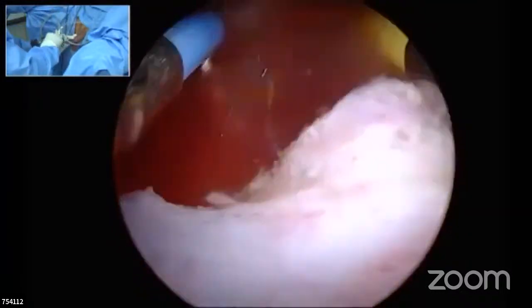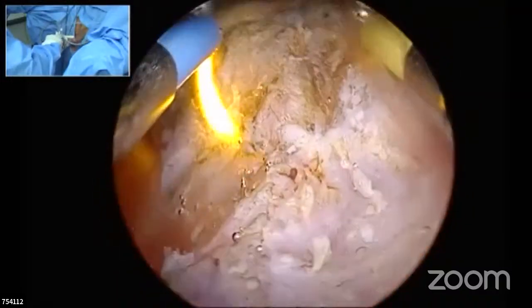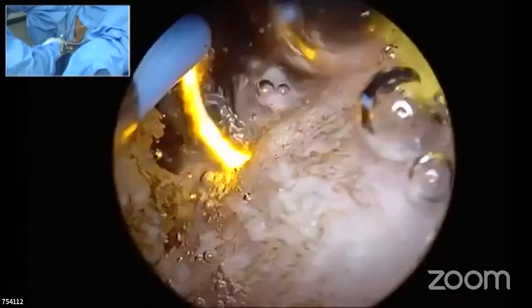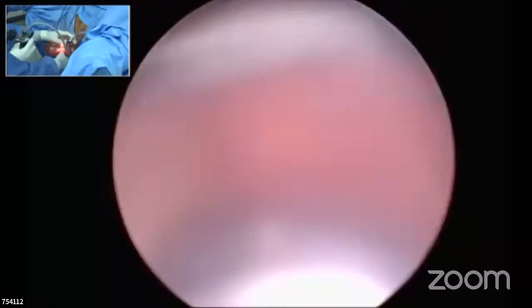But Malik, for bipolar, don't you think your loop has to be a little slower than the way you are using it? Yeah, I am doing it my slowest way, sir. I'm sorry to say that. But yes, your point is absolutely true. In fact, the advantage of a bipolar is when you do it slowly.